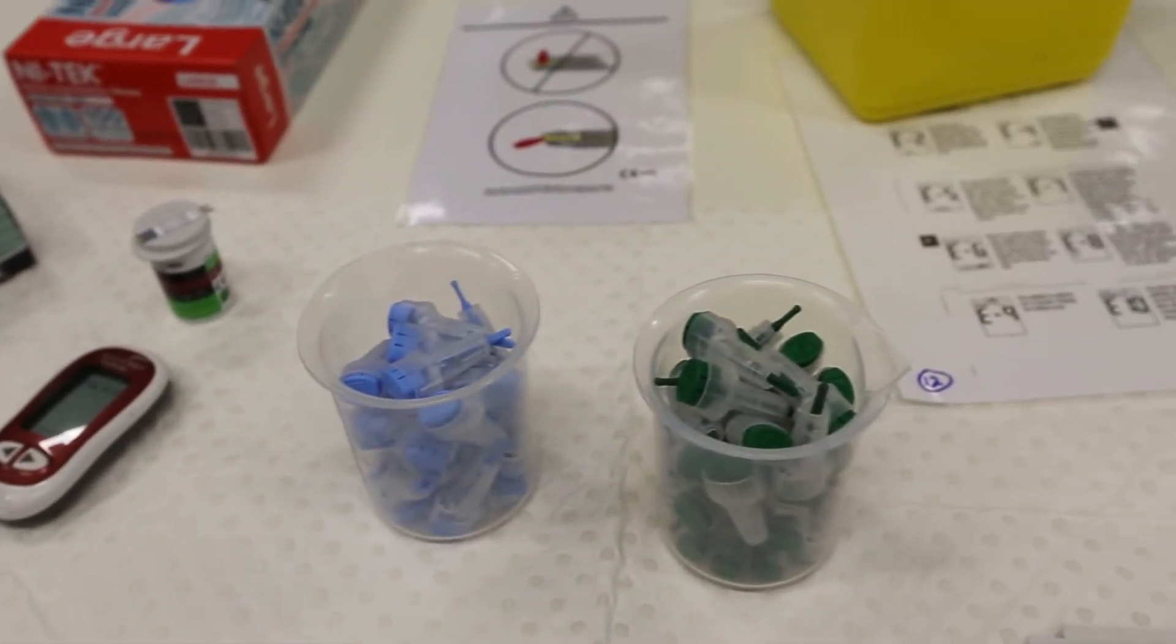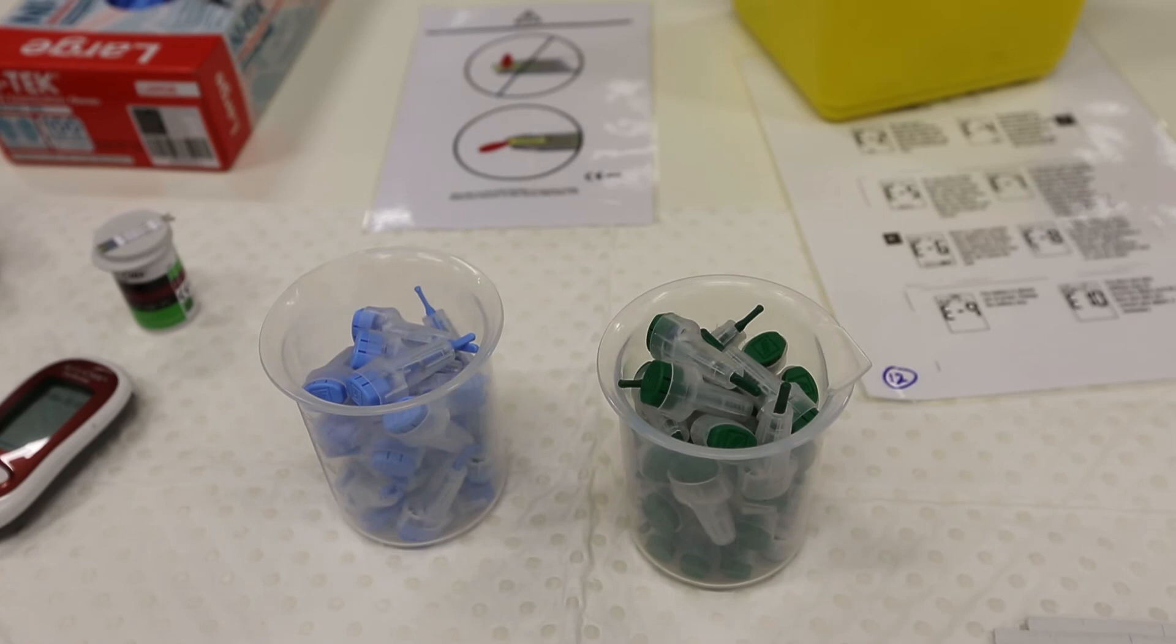The lancets that we will be using come in either blue, which is very shallow, or green, which is shallow penetration depths.